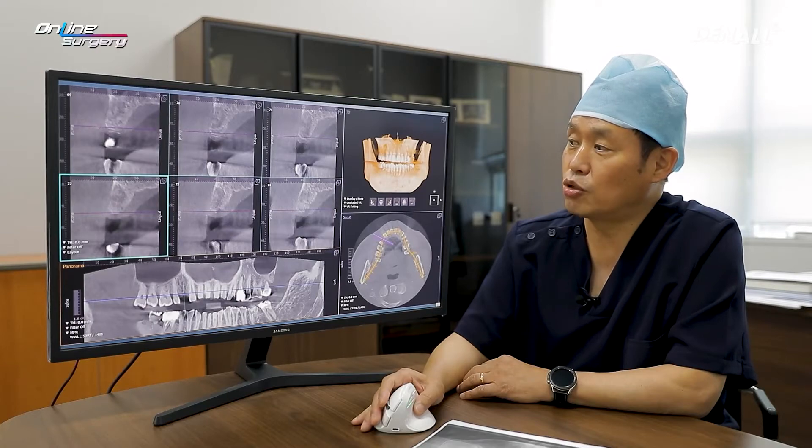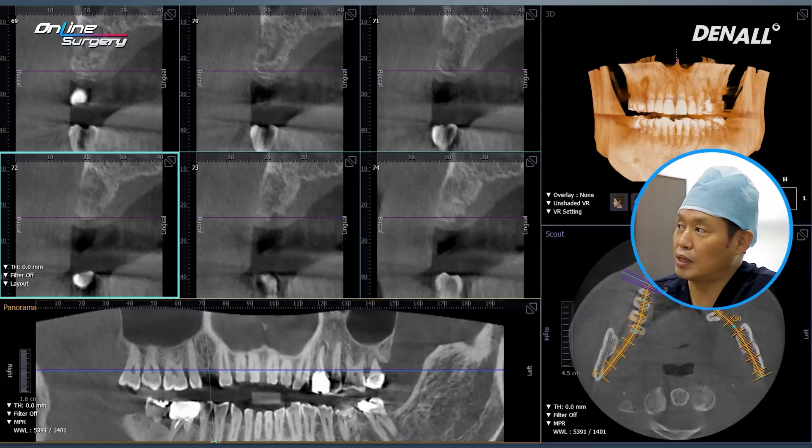It has been approximately 6 months since extraction, and there is somewhat bone healing within the socket. Because there was alveolar bone destruction before extraction, there is a little bit of radiolucency in the medullar portion. However, alveolar bone thickness shows no major issue.